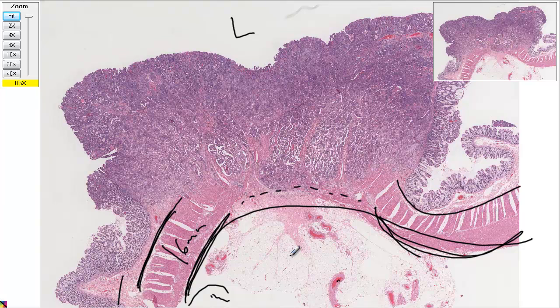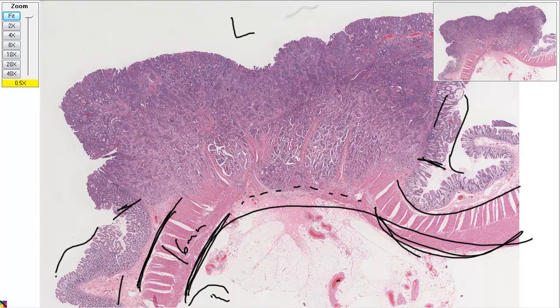We have the normal over here for the lining. This is where it's going dysplastic — looking a little bit bad there. Now what happens is you've got these edges of dysplasia.